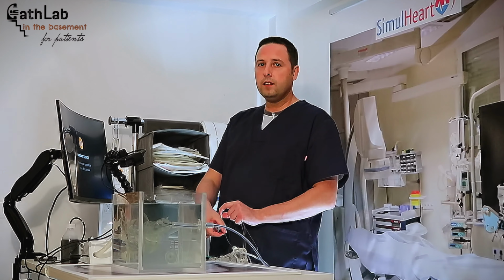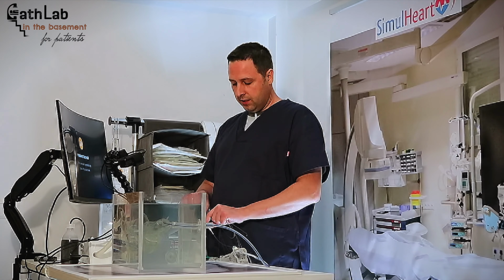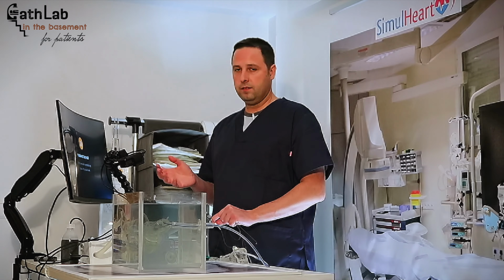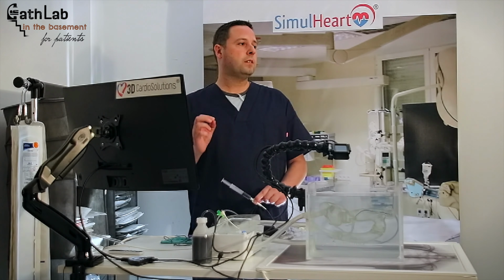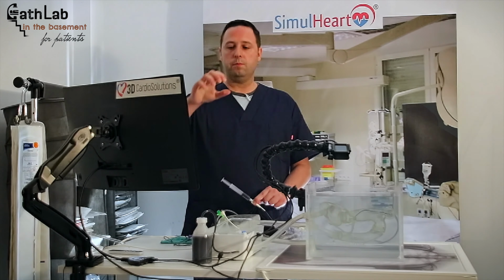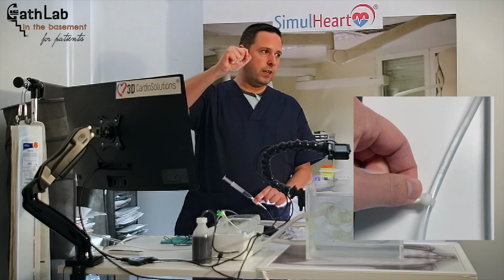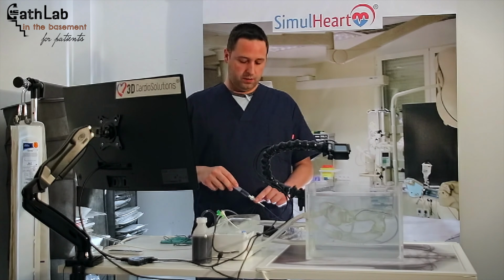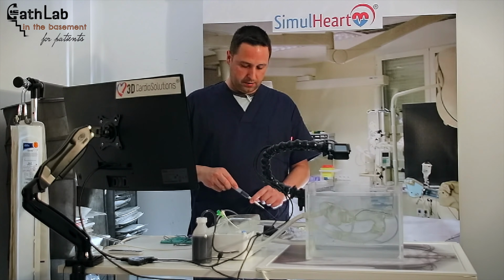This is a thin catheter that is highly flexible, and when we go throughout the arm you should not feel anything. Sometimes there is a little bit of pain that is due to spasm. That is when the arteries do like this, they spasm. And there is some medication that we can give you so that you can feel better about it.